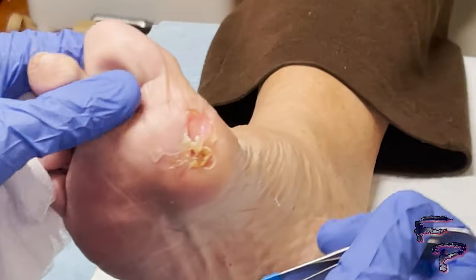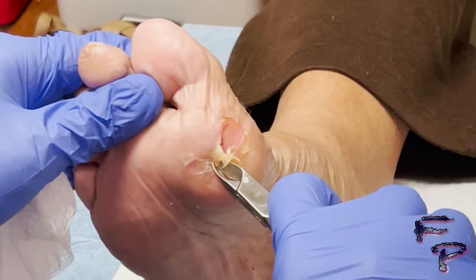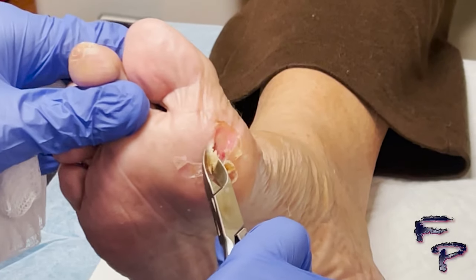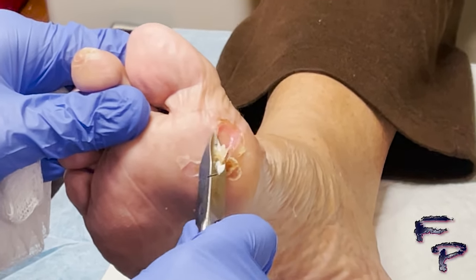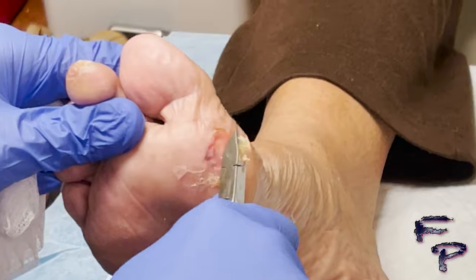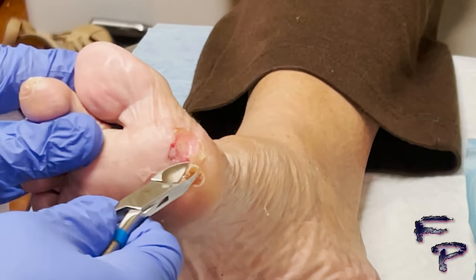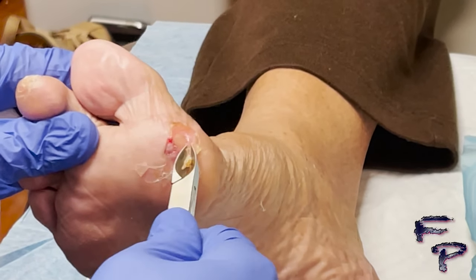Using the tissue nippers and trying not to damage healthy appearing tissue, I push underneath and lift upwards, separating from the good tissue and working my way around the wound. Care is taken not to damage healthy appearing tissue — I slowly go underneath and push upwards to separate.